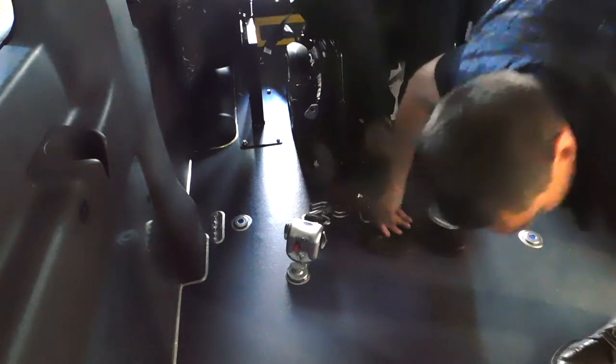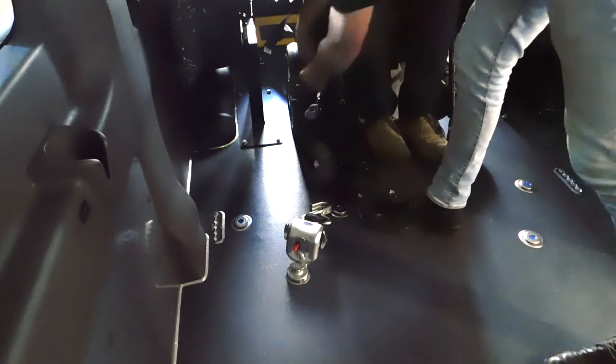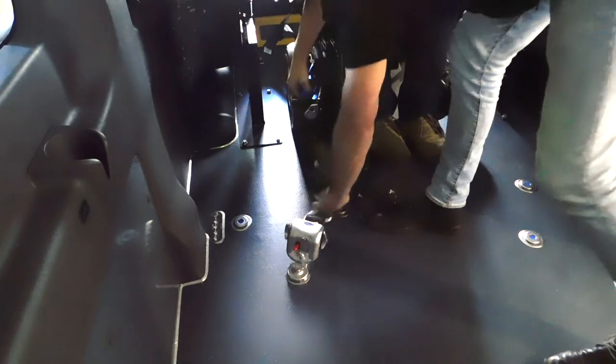When you've got your wheelchair central to the anchor points on the floor, turn the wheelchair off and apply the front five series restraints.